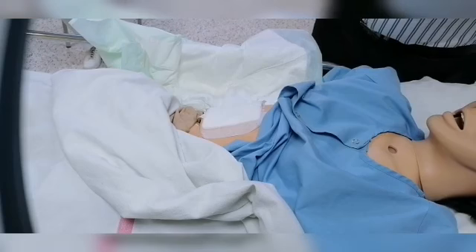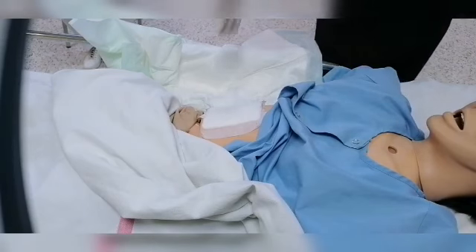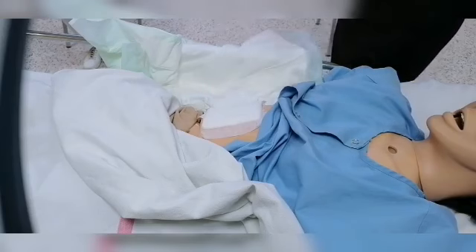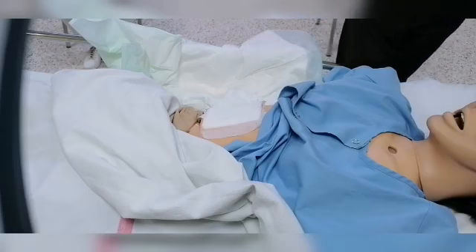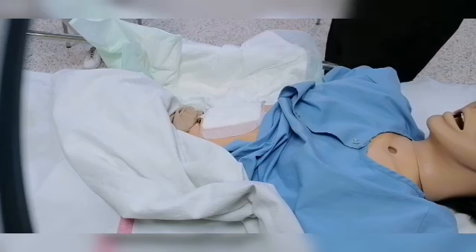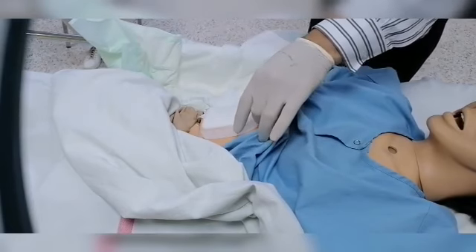Then I have to wear disposable gloves in order to take the previous dressing out. Before taking the dressing, I will check the dressing. Is it soiled? Is there any secretion coming out? Is there any drain beside that dressing? So all of those things I have to assess before starting the dressing itself. Then I will come to get out the previous dressing.